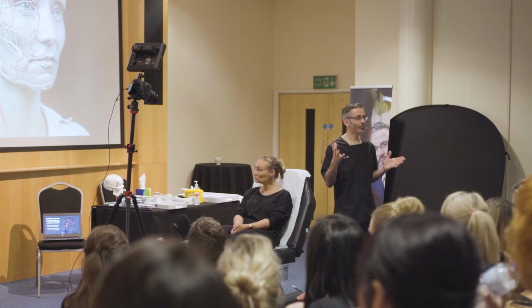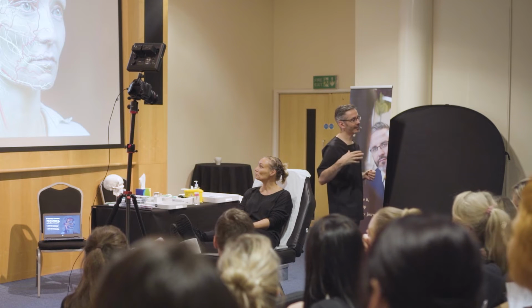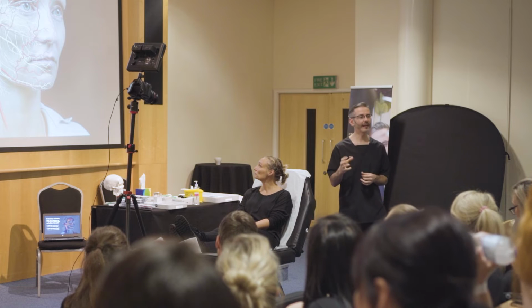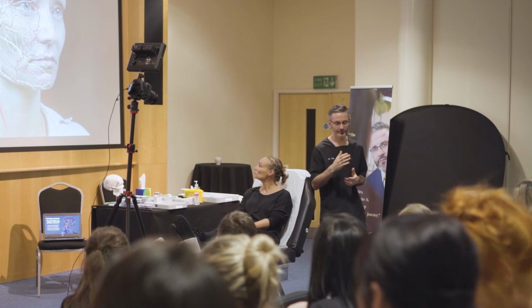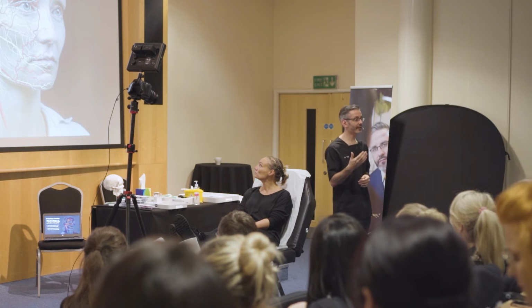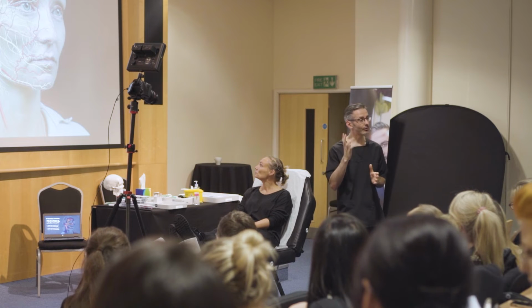Where I'm injecting here, what are the structures that could go wrong? Over your career, you should collect as many stories as you can of real complications, because they come into my head just before I inject. Still, stuff I read in a forum 3 years ago. I'm like, remember the infraorbital artery is vulnerable if you angle slightly differently. That came from an awful complication I saw in the ACE group, and it's changed my thoughts as I inject each time.